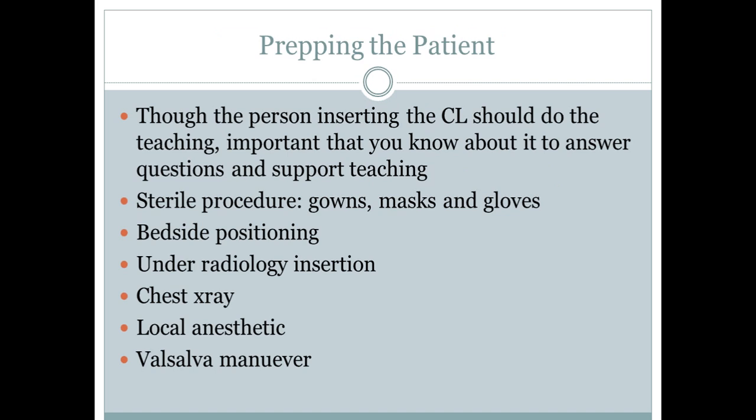Prepping the patient for a central line or a PICC line or midline is pretty much the same as you would with the IV. It is going to require more education and knowledge for the patient, especially if this is going to be something that the patient goes home with as far as care. We're not going to get into home maintenance for the patient, that patient education, but it is important that you do know about it so that if the patient does have some questions for you, you're able to answer them.